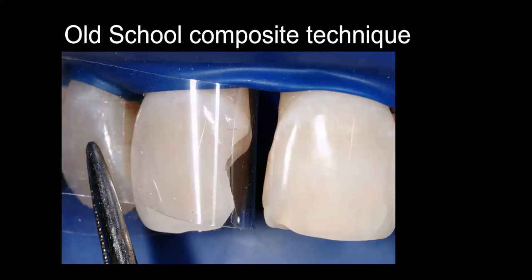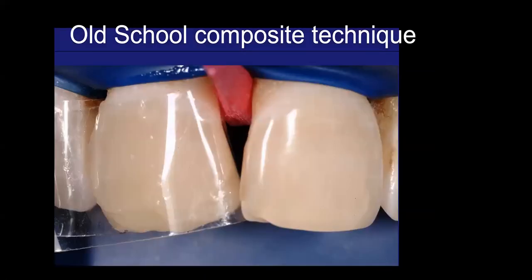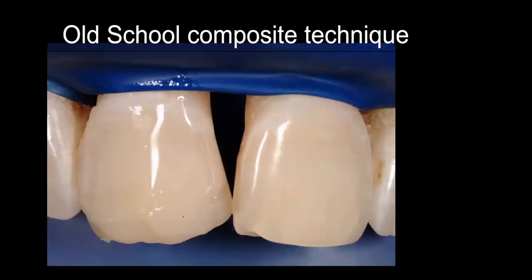All right, perfect. All right, so let me tell my story. This was 25 years ago, I think. I'm just out of dental school. I have my new camera, and I've got my flat mylar, and this guy came in. He had an old filling, took it out, and this was the standard of care. I put a wooden wedge in there because that's what we had, and I had a really nice margin on this. I was so proud of my margin right here.